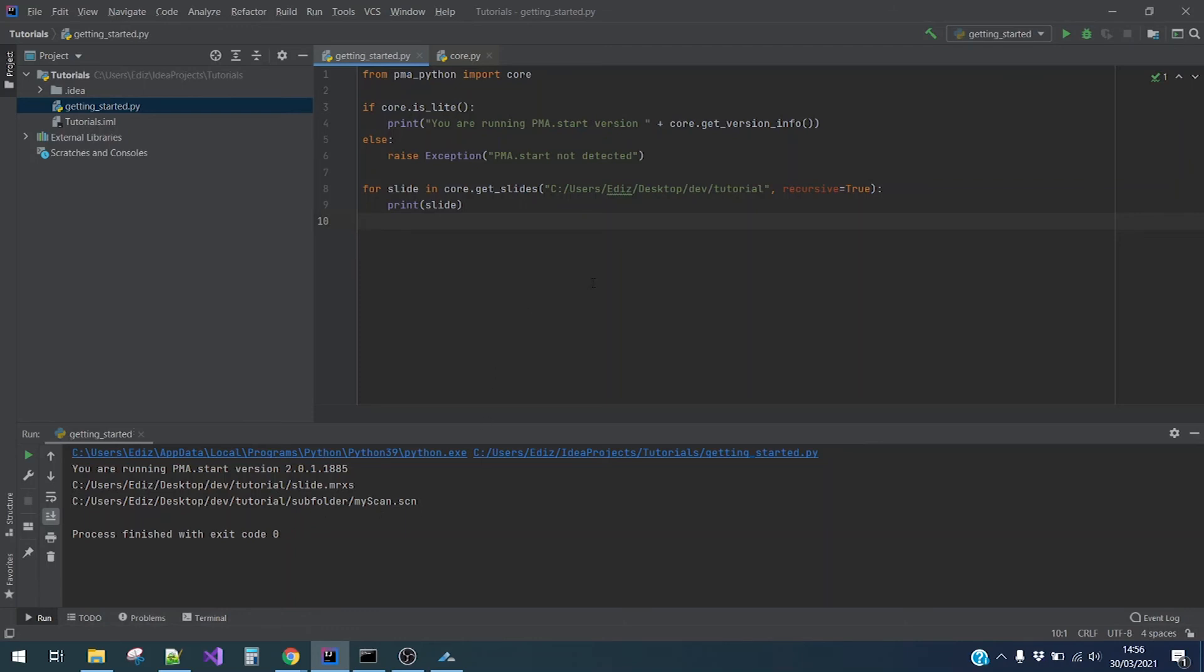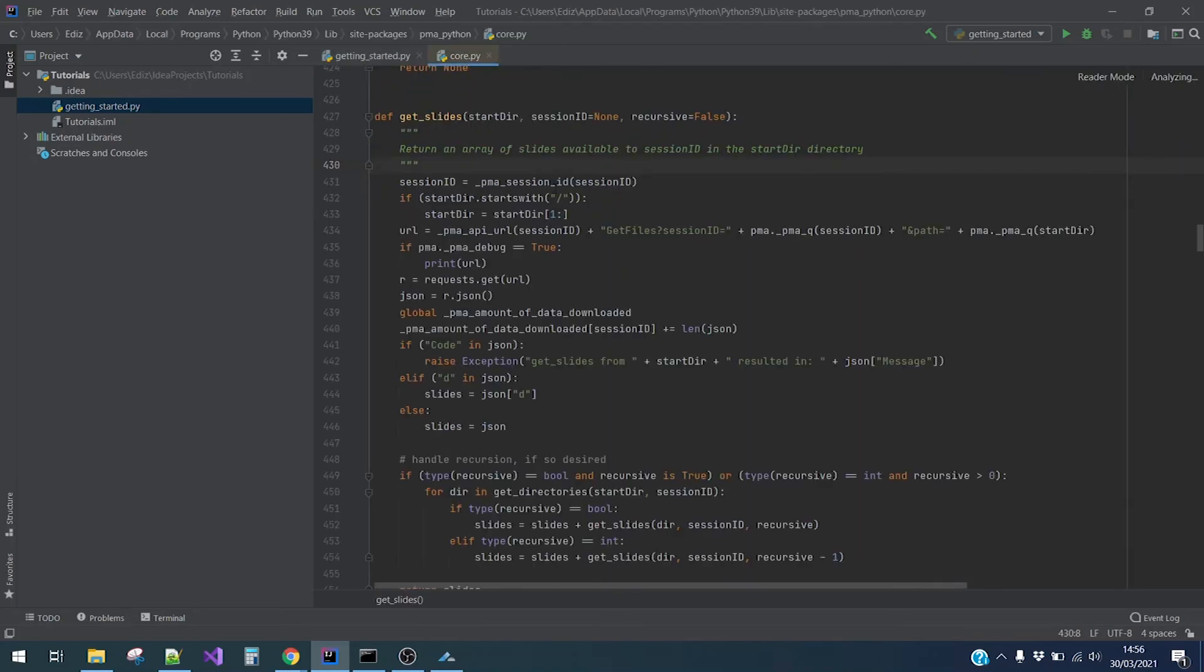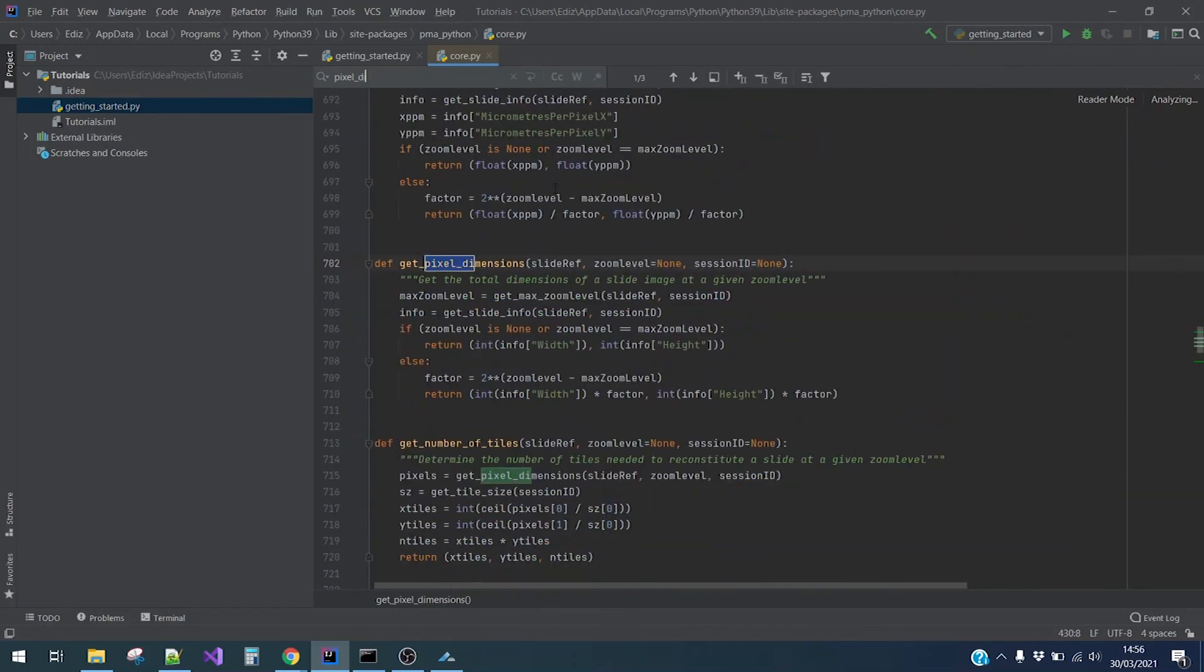Lastly, let us take a look at another method. I will search for getPixelDimensions. We can see that this returns the total dimensions of a slide. Let's try that.